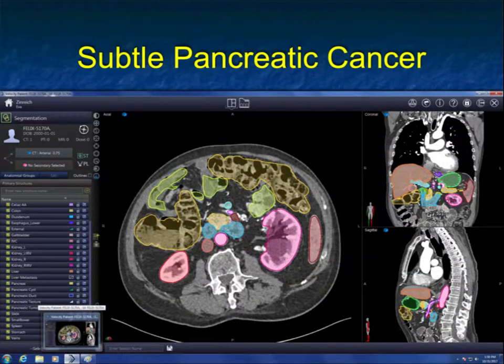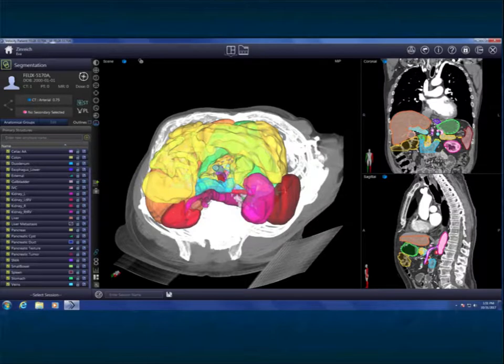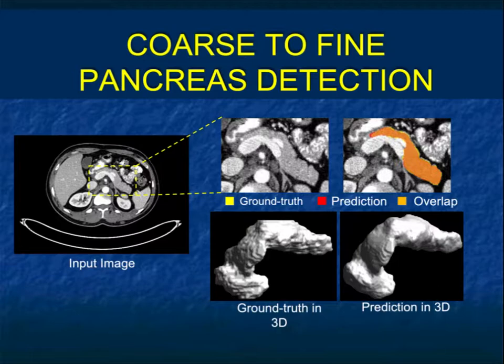And so we labeled several thousand pancreatic cancers. You can see one example here. Again, we taught the computer how to recognize what's tumor versus not tumor. We taught it to recognize neuroendocrine tumors, and recognize cysts. Again, detection is step number 1. And then once you have detection, it's classification that becomes very important. We developed many different computer algorithms.